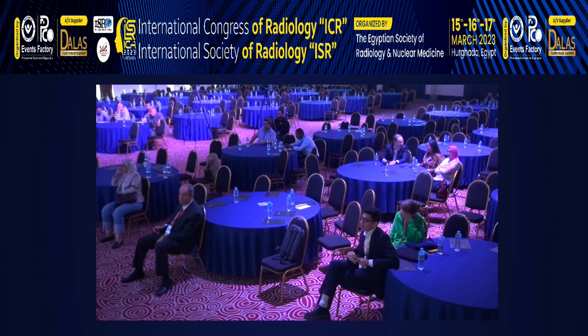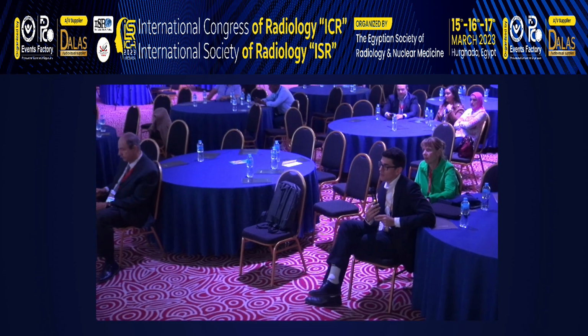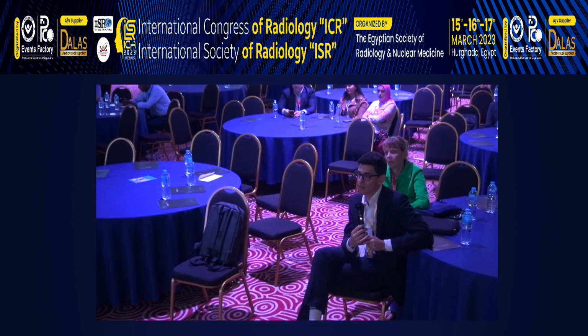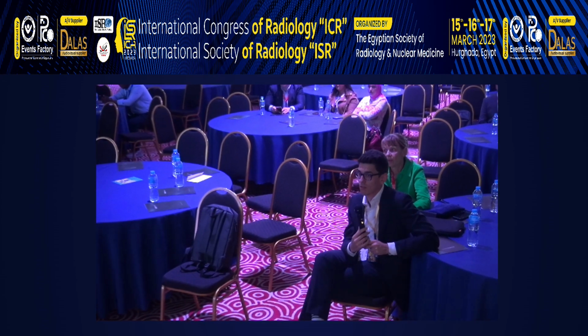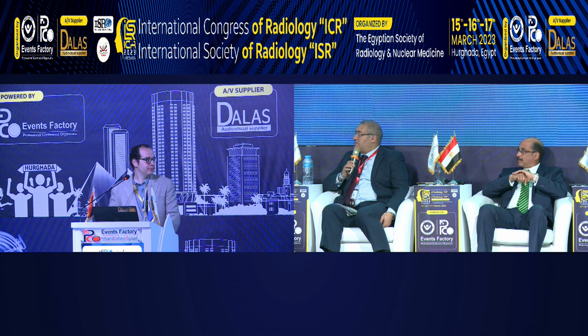Dr. Kerim. Thanks for the talk. When you have such a pseudoaneurysm, it has no real lumen. So I wanted to ask, when you coil it, do you coil the aneurysm or...? No, I coiled the feeder vessel, just the feeder before I reach the aneurysm. Did it ever happen that the coils prolapsed? No, because I upsized the coil to the parent vessel, so it doesn't go up. Any other questions? Thank you, Dr. Ahmed.